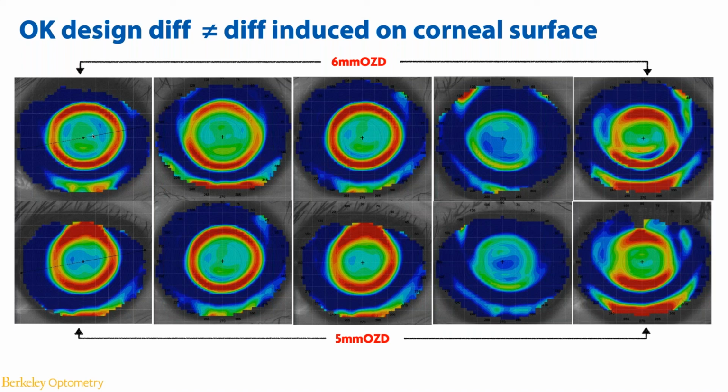So the reason she didn't have that hot ring was because of her lower prescription and a flat cornea. So her paracentral steepening is not as dramatic as compared to the other subjects. And the reason that paracentral steepening is not perfectly round was because she actually wore the lenses to school for the follow-up. And so the fitting of the lens in her waking eye and sitting up position was very different than her closed eye condition, hence creating a little bit of a secondary molding in her several hours of waking up wearing the lenses.